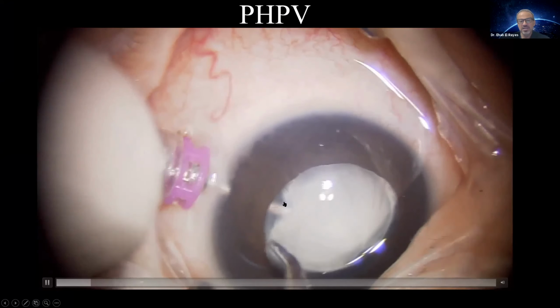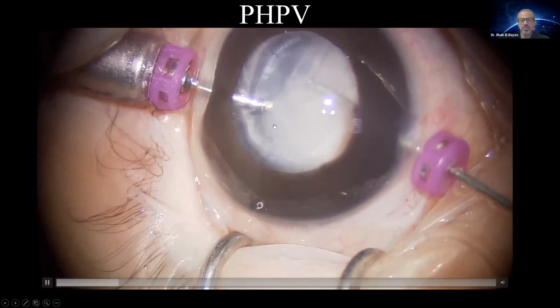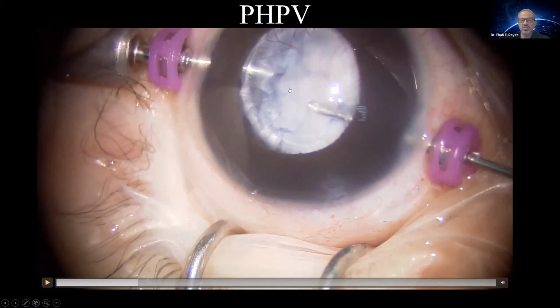I can see it inside the lens, then I put the cutter, remove the lens. We have 2 membranes to deal with. One is the posterior, and that's where the retina might be attached to it by the fibrovascular tissue in the PHPV, and the anterior one. The anterior one is responsible for the contraction that happens in the ciliary processes right here. So this is what I'm going to show you.